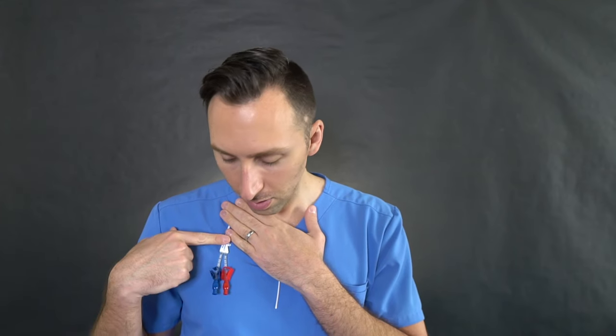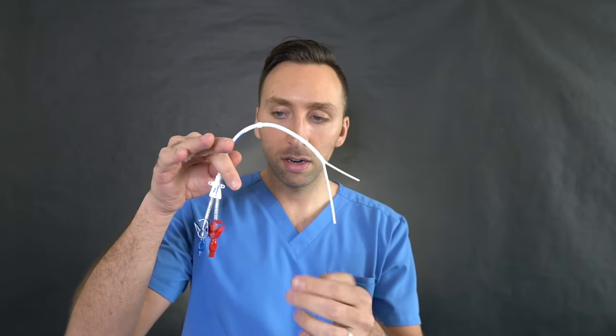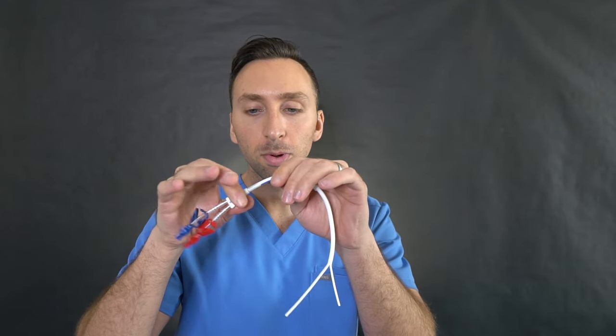Peel the sheath off, and now you have the catheter hanging just above or in the right atrium. All of this is underneath the skin and within the chest cavity, except for this little hub with the two injectable ports hanging out. So this entire section from here over is inside or under the skin, and this part hangs in the right atrium — this part is on the outside. This is what a tunneled hemodialysis catheter looks like. Only this part is exposed so you can use it as your means of dialysis.